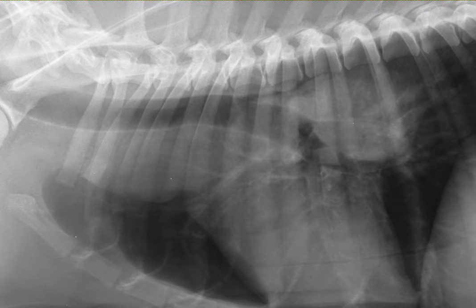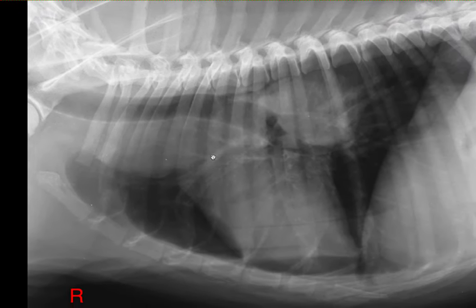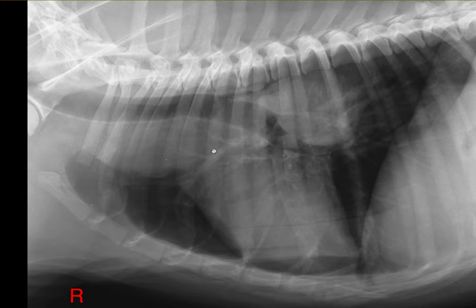Looking back at the lateral radiographs, we can conclude that this dog has severe lymphadenopathy. This one here is going to be the middle tracheobronchial lymph node, and this is going to be probably the left lateral tracheobronchial lymph node. Probably the cranial mediastinal lymph nodes could also be enlarged.